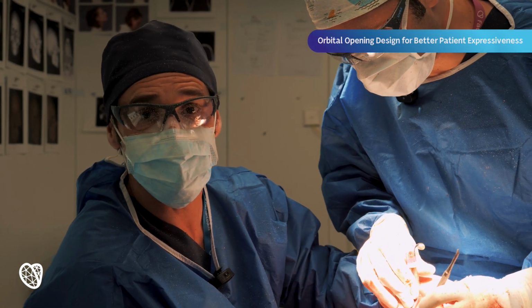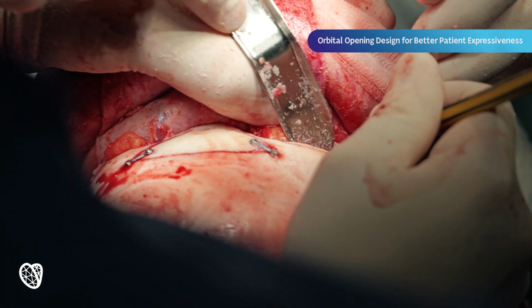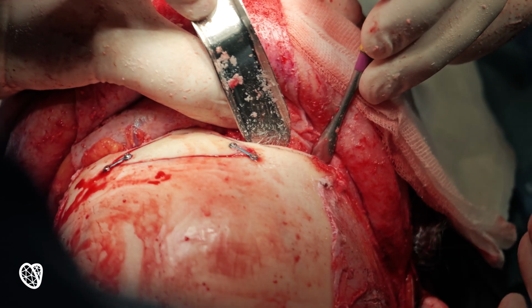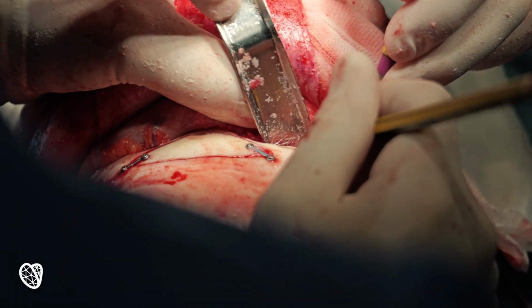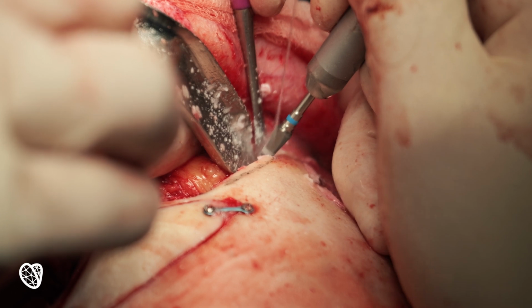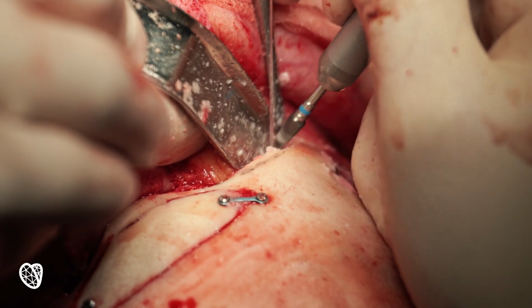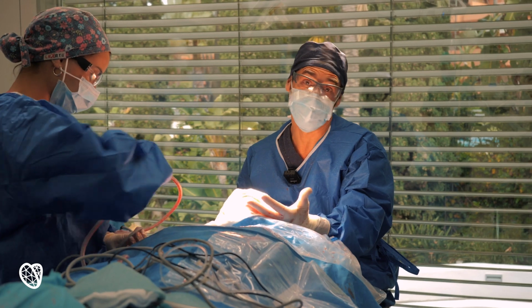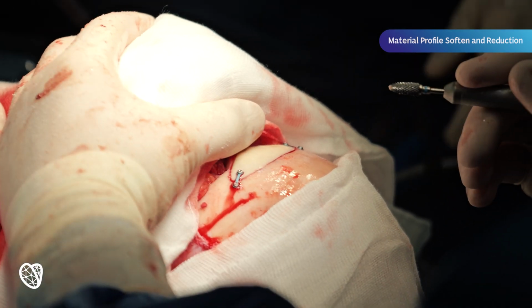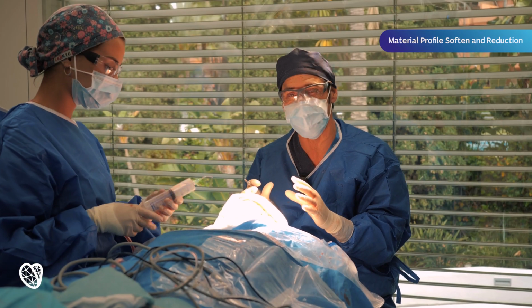Now we are designing the orbital opening. The orbital opening is a very essential maneuver to better expose the periorbital content, making great changes in the patient's expression. We are getting close to the end of the surgery. Now, a very nice step we are going to make. We are going to soften and we are going to reduce the profile of the material to make it really unnoticeable.